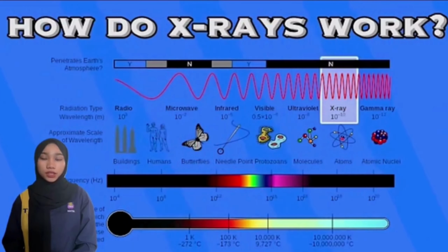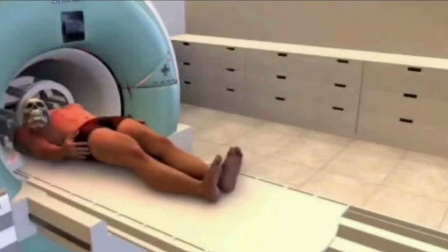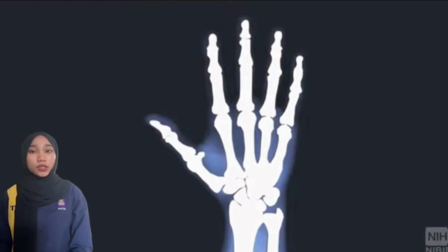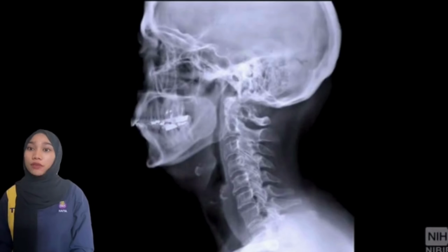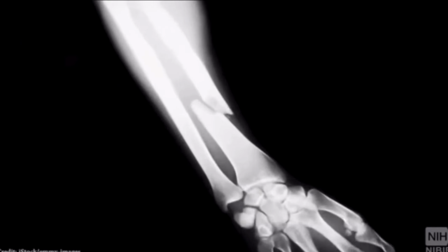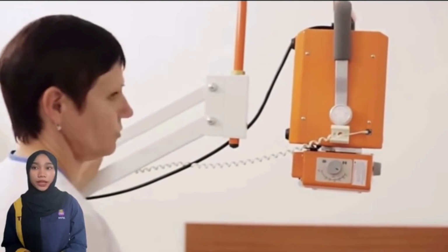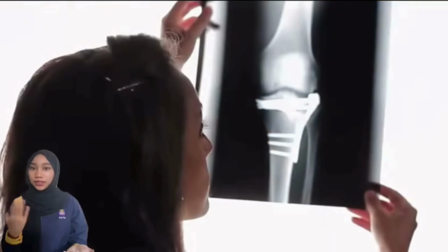Benefits of radiographic technique in X-ray imaging. The first one is minimal radiation exposure. It has less exposure than other machines such as CT. The second one is that it is quick to perform. X-ray imaging is relatively fast and convenient, making it suitable for emergency situations where rapid diagnosis is crucial. The third benefit is that it is cost-effective. X-ray equipment is widely available and less costly compared to other imaging modalities such as MRI and CT scan.